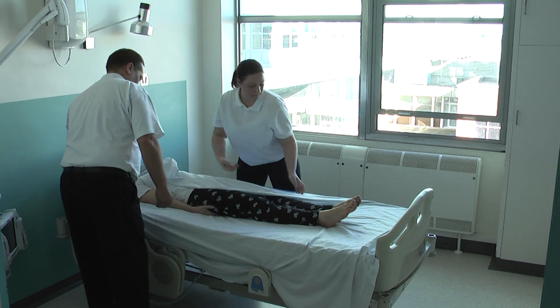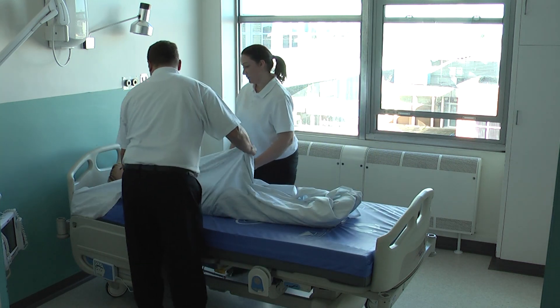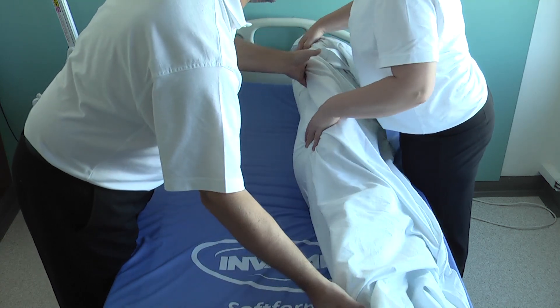Wrap them in the bottom bed sheet. This will help to keep the user secure during the transfer onto the ALBAC mat and adds a layer of warmth during the evacuation process. Roll them onto their side ensuring they are supported.